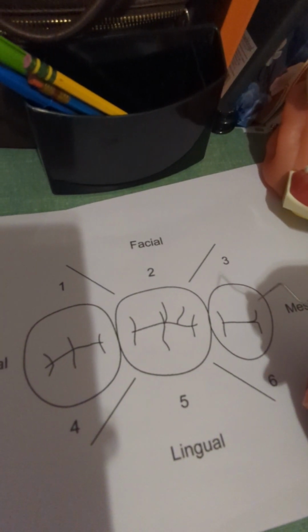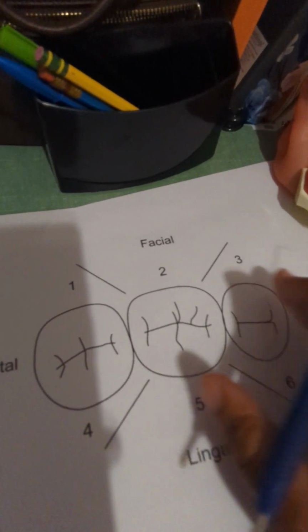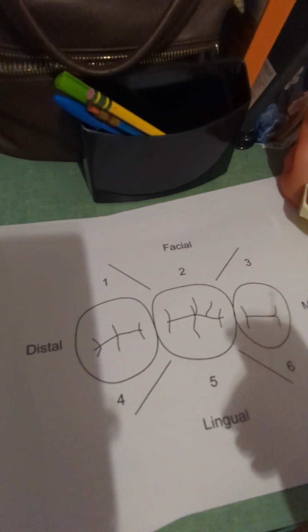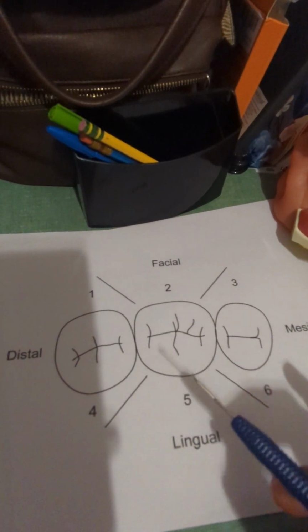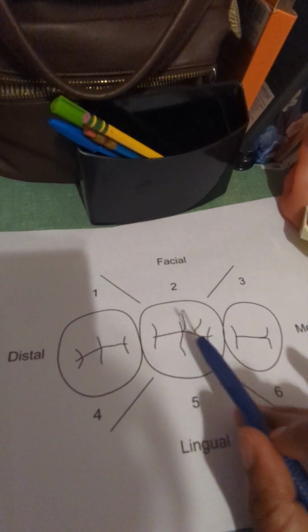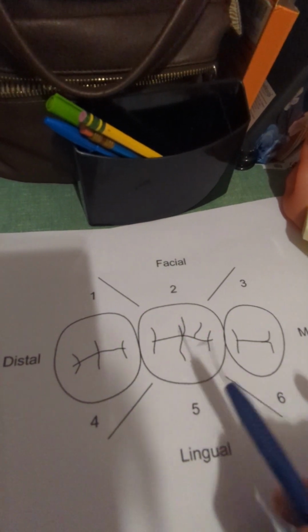Okay, before we move on to our technique, I have an image of a tooth to have an idea of what exactly will be done. So, when you are probing, you will start, and this is a molar. We are looking at, it seems to be our first molar.